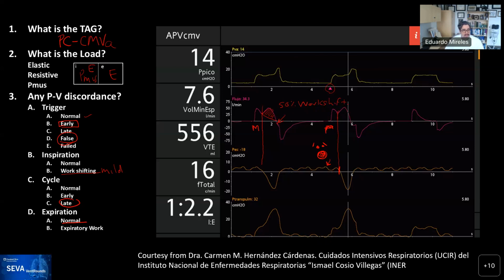Actually, over the weekend, when we were in ARC, we saw a ventilator where you can program how fast it changes the pressure depending on whether you're outside or within the range. So really interesting, Chip. The algorithms are not the same for every ventilator. Rob? Exactly right. And there's no way to tell from the manual. No way to tell from the manual. All righty.